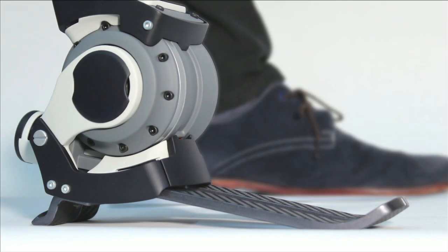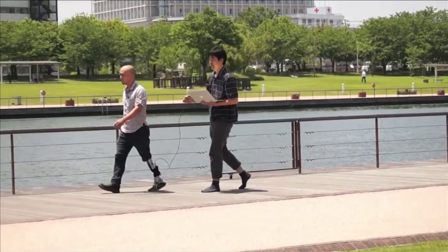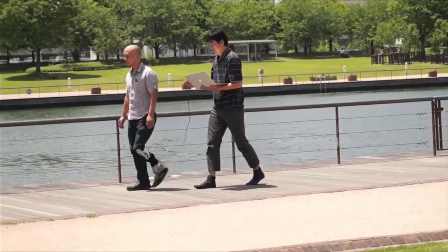So one of the simplest solutions is robots. I put a motor at the ankle to push off the ground. In my case, moreover, I put a parallel spring to support the motor output in order to minimize the motor size. And a few days ago, I tested it on my friend. He's my first pilot, and he walked on my robotic ankle. And I saw a firm advantage of putting the motor on the ankle in terms of the metabolic cost expenditure, even though it weighs more than the actual leg.